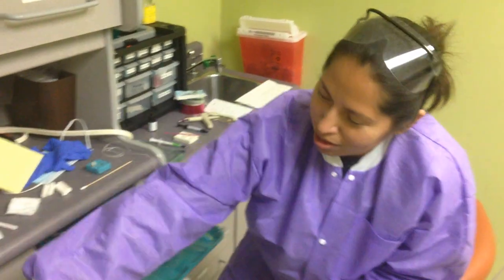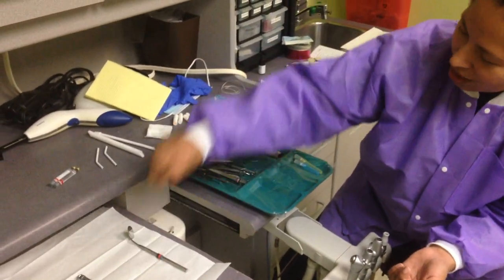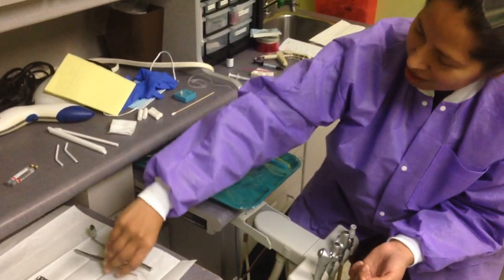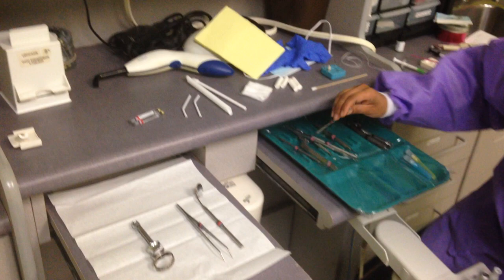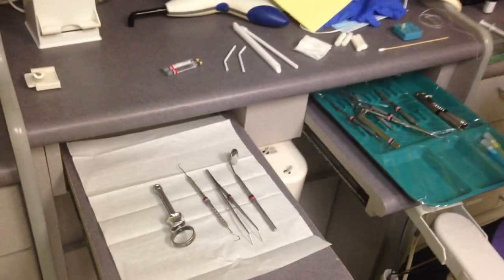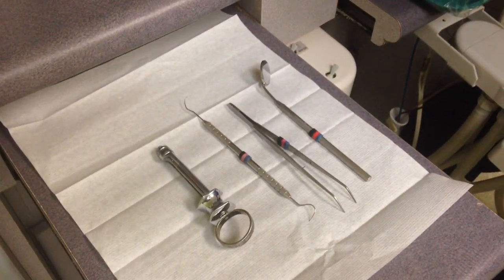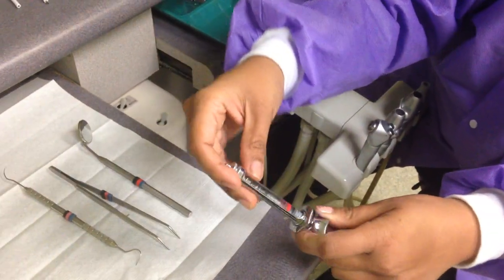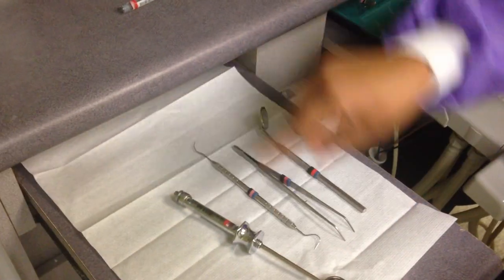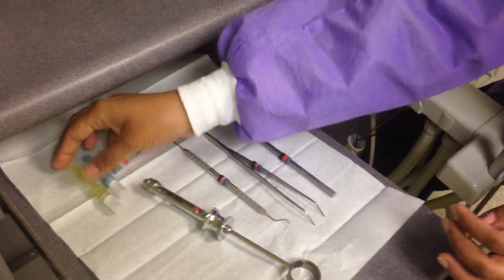You've got your needle or your syringe, your mirror, your cotton pliers, and your explorer. You're going to set up anesthesia here. Anesthesia starts off with the lidocaine — here at Search we start with the lidocaine.